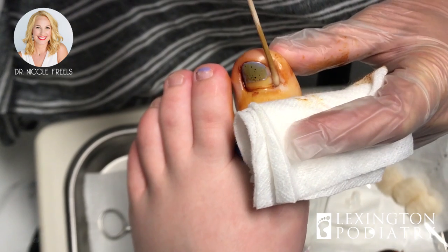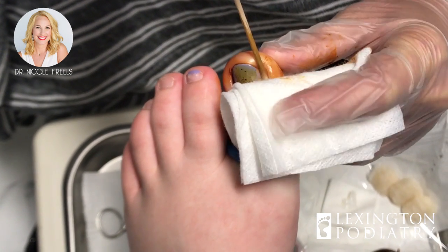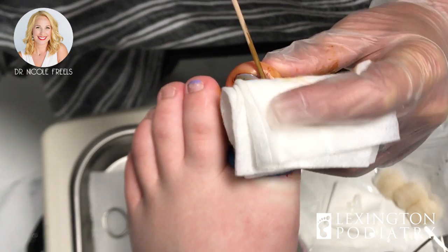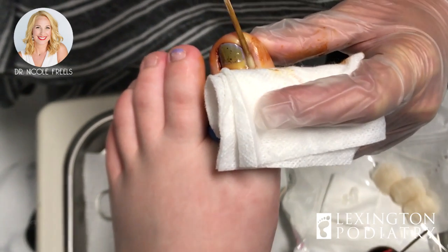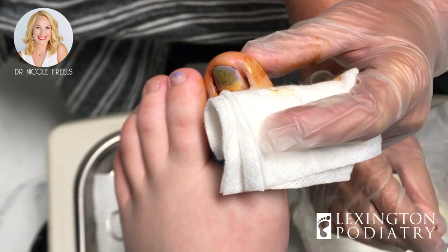Just to remind you, there's about a five percent chance. Feel a little burn — can you stand that for about 15 seconds? This is making sure it doesn't come back. Just take some deep breaths for me and then I'm gonna cool it off in just a minute. Almost there.